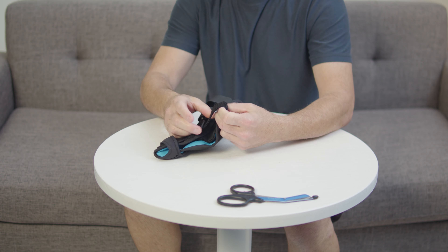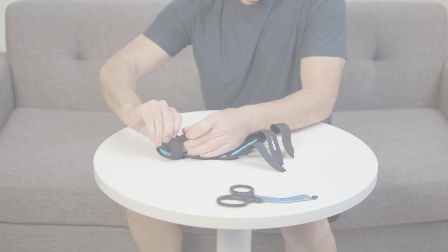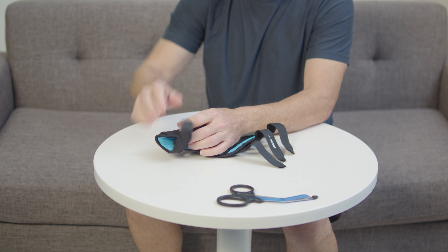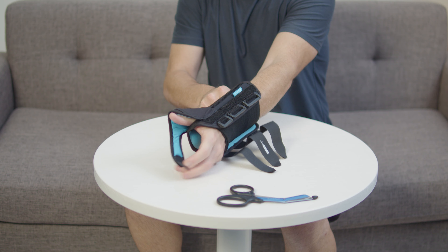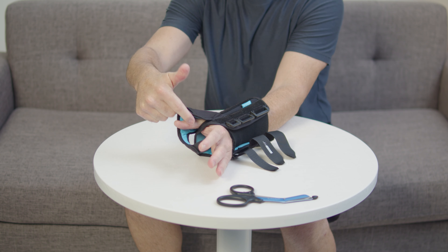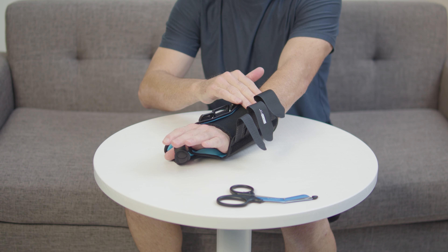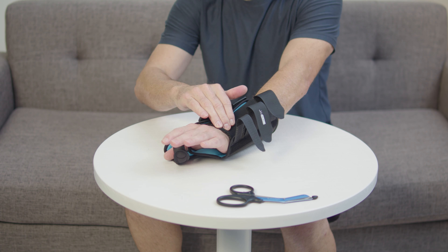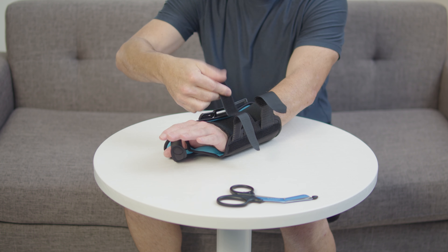Undo all contact closure straps. Slide hand into the brace and thumb into thumb support. Ensure stockinette is positioned on top of the hand. Fasten all contact closure straps and secure to a snug fit.